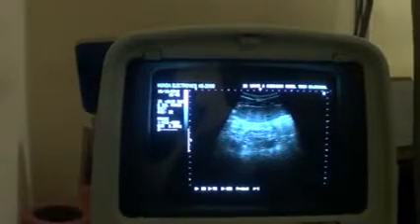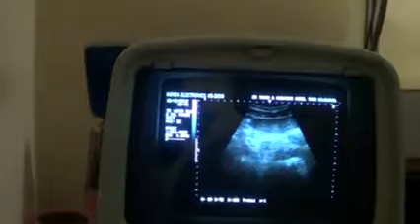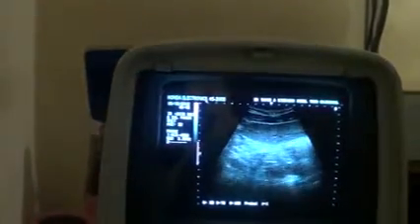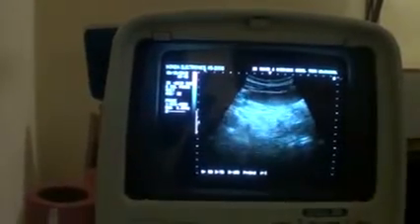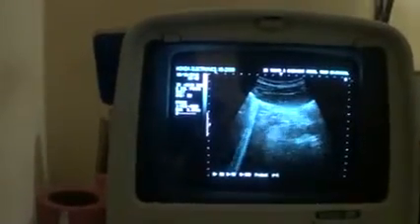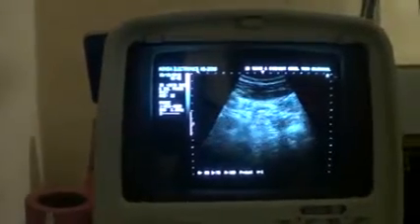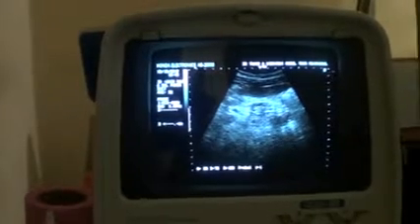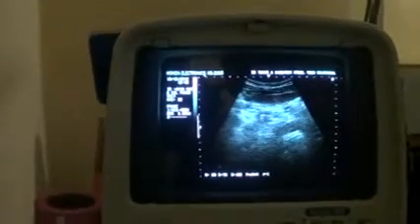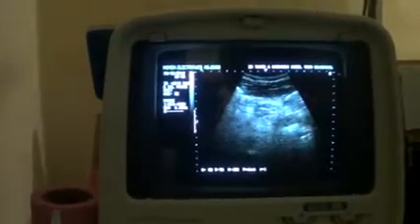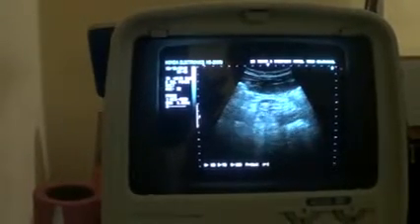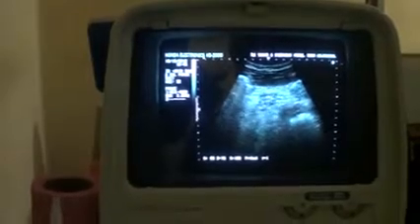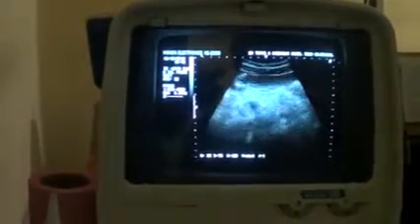This is the normal view in which we scan - the pancreatic tissue is seen. Now if I move the probe to this area, this is bowel, not the pancreas, because we do not see the landmark splenic vein coursing its posterior border. And if we keep the probe here for some time, this area will change its shape and you will see gases from this area, suggesting that this is the bowel, not the pancreas.